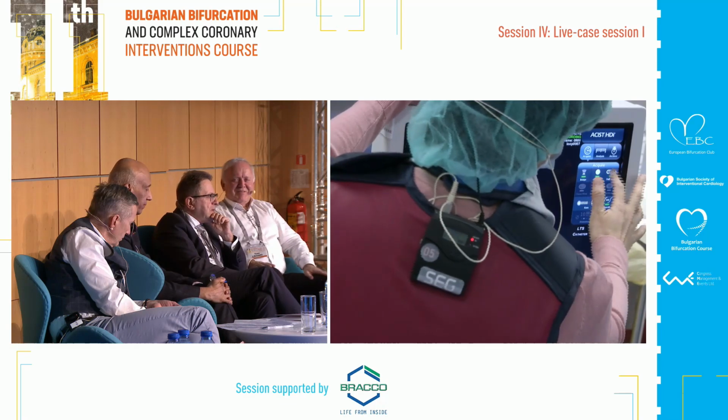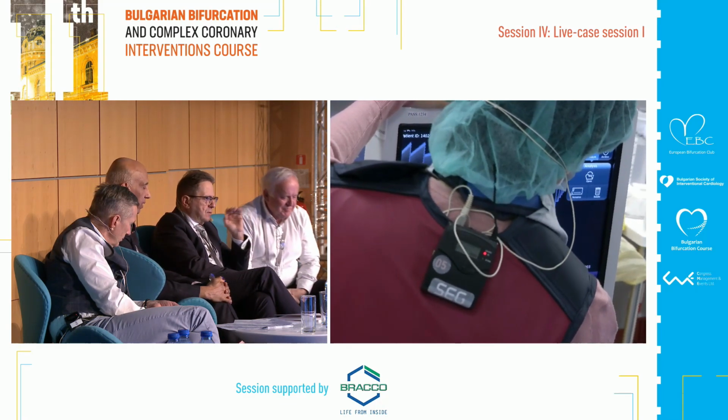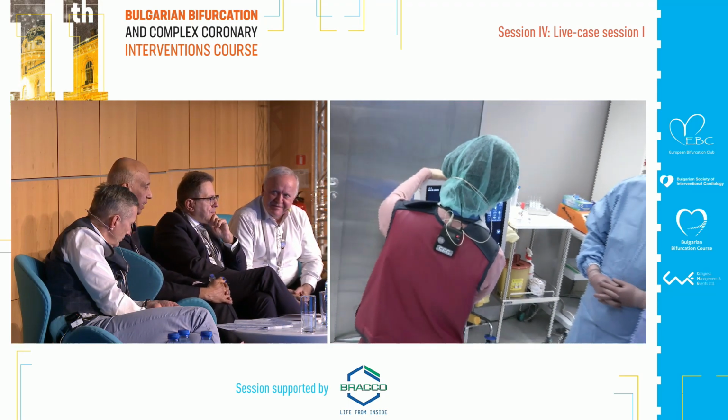There's some protrusion into the left main, but on one side, of course. That's good. Yes, that's good. You are done. I don't think you need another angiogram.